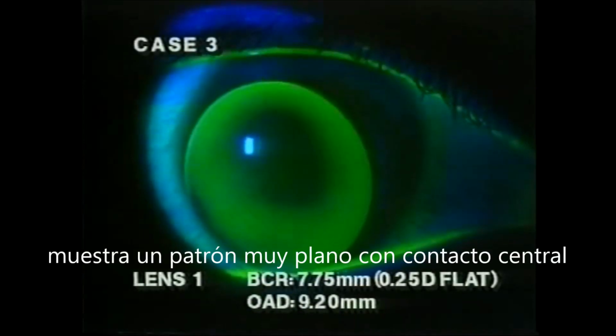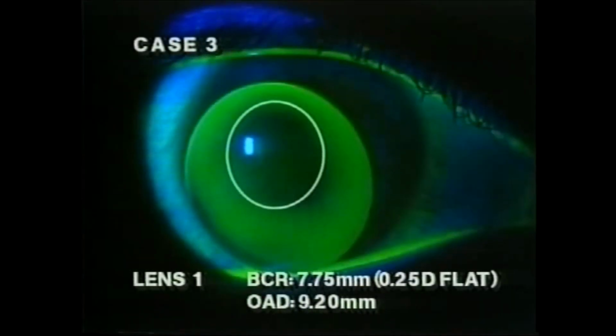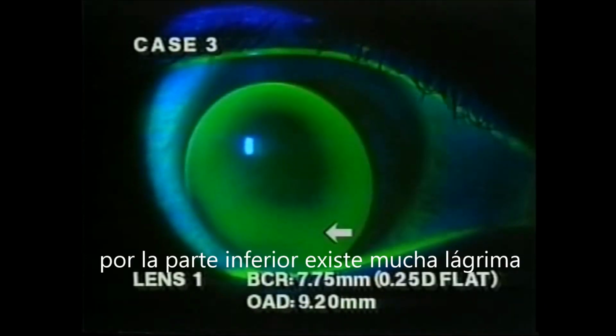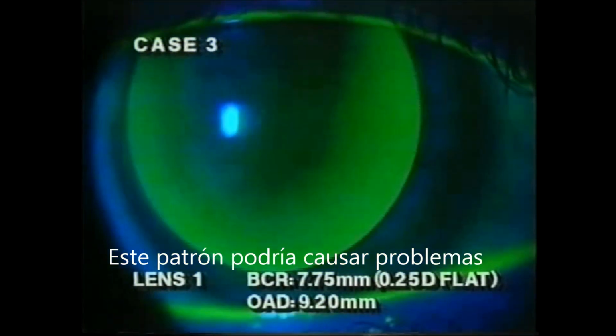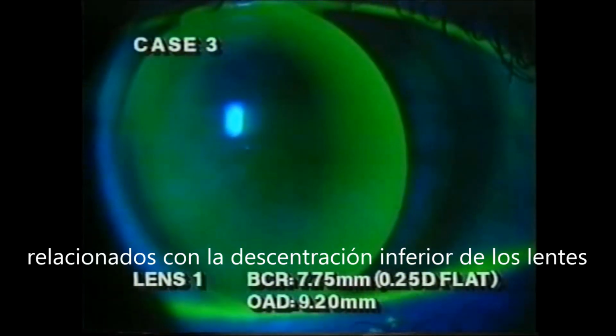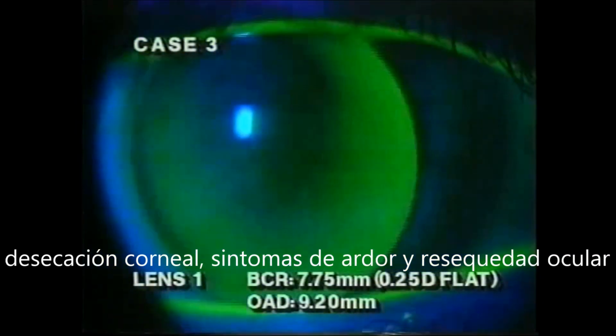Fluorescein evaluation reveals a flat lens pattern with bearing centrally along the vertical meridian, along with mid-peripheral clearance and peripheral bearing. This design could cause problems characteristic of an inferior decentering lens, corneal desiccation, symptoms of flare, and lens awareness.